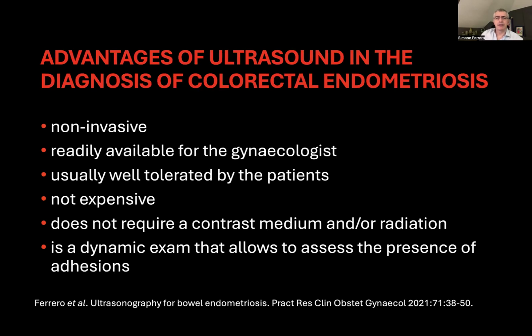Ultrasound is particularly useful for the diagnosis of colorectal endometriosis because it is non-invasive, it is easily available for the gynecologist, usually well tolerated by the patient, it is not expensive, does not require the use of contrast medium or the use of radiation, and it is also a dynamic exam which allows to establish the presence of adhesions.